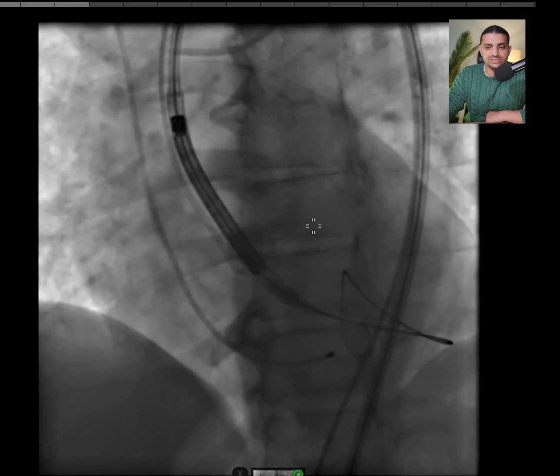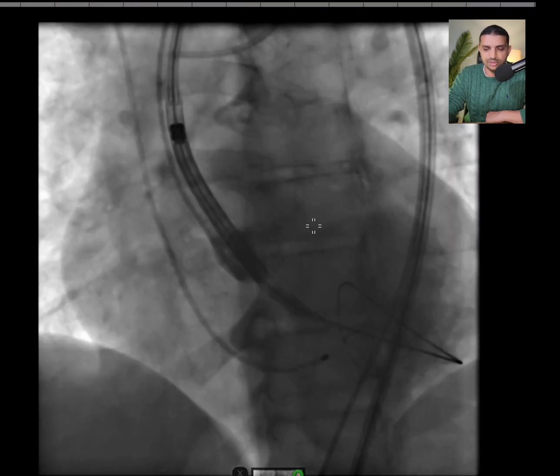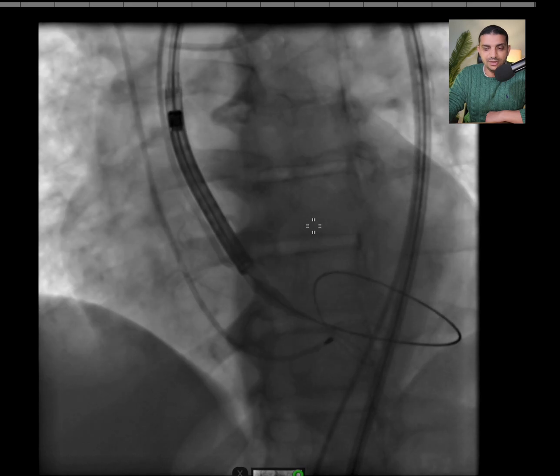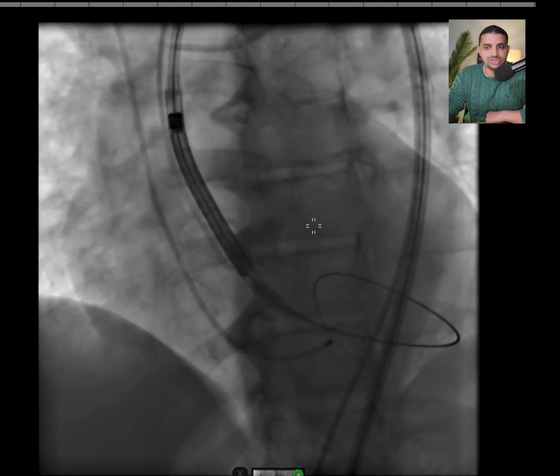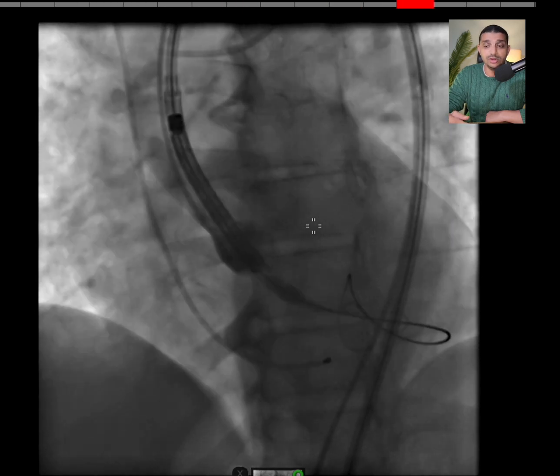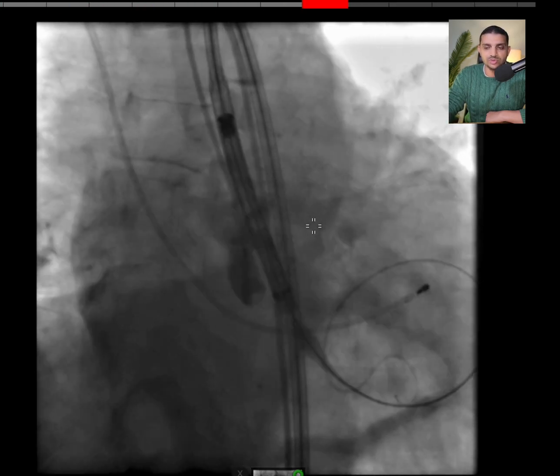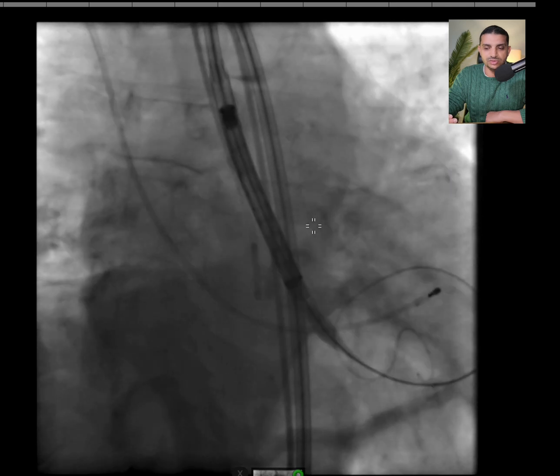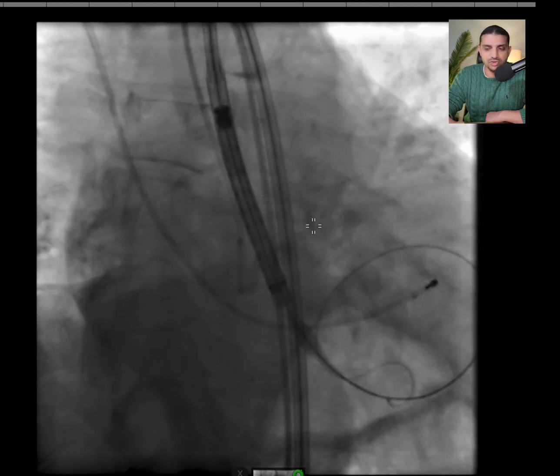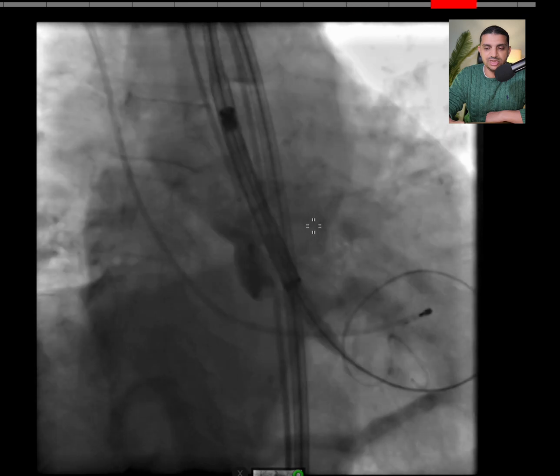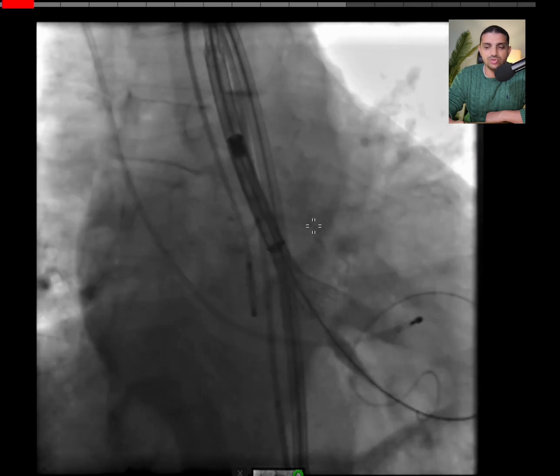First we make sure that we are below the annular plane. Then we move on to the right caudal views — the cusp overlap view — in order to remove the parallax, as you can see here. I've moved into the cusp overlap view; this is the right caudal view. As you can see, the hat marker is just a line, and this means that there is no parallax.